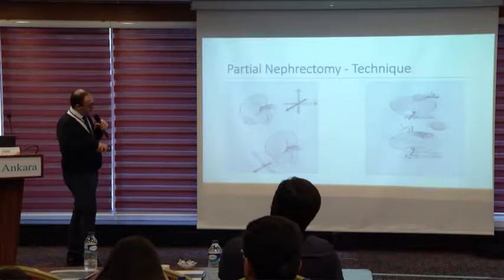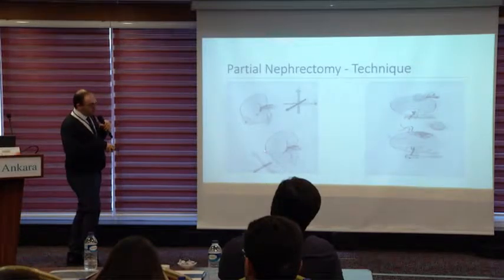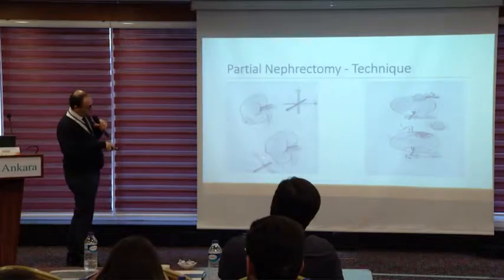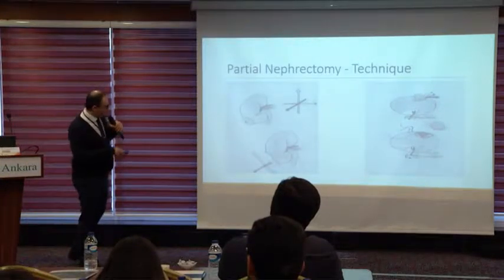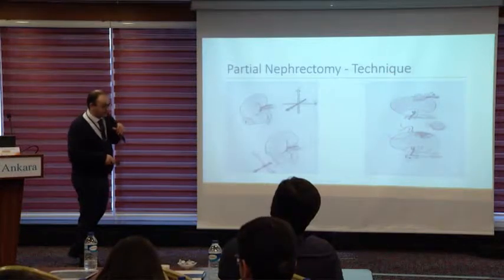Now, if I take the y-axis along the line of suture, this is my choice, the y on the line of the suture, my needle stays on the z-axis and my needle holder comes from the x-axis.